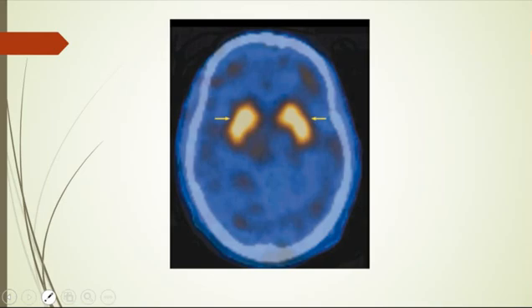Which tracer do we have? What's the radio tracer? What's the substance? What's the material? We said it last session, this is iodine 123. Okay?